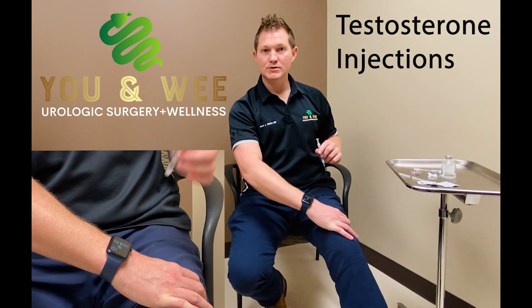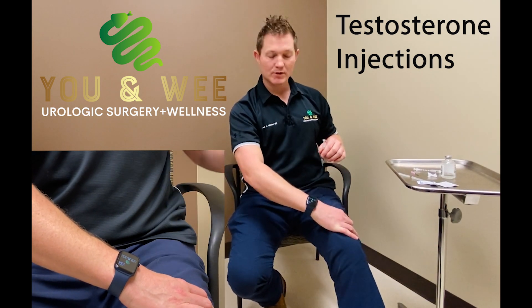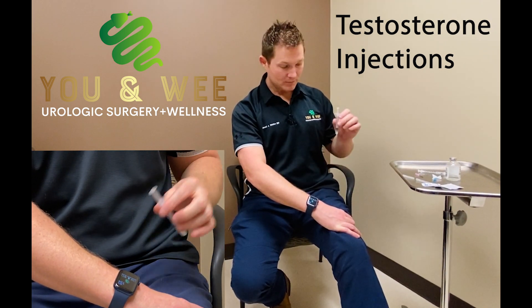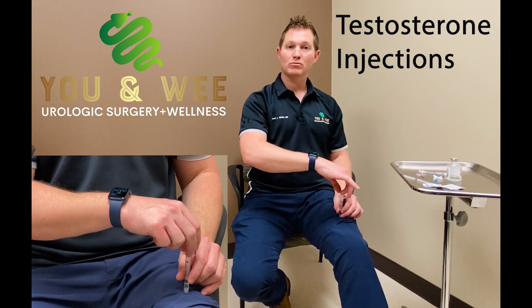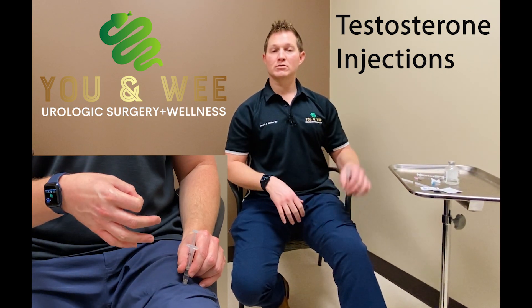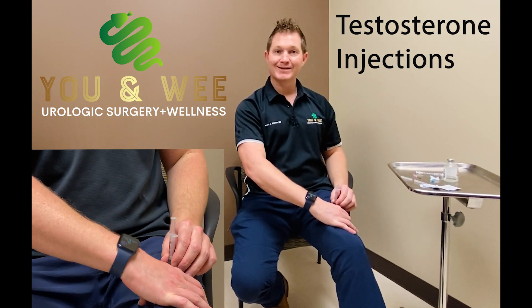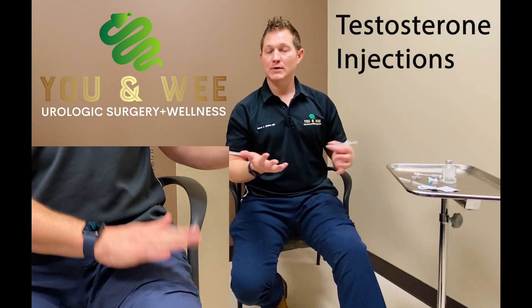Grab the muscle on your thigh and make sure your leg is nice and relaxed — you don't want to tense up. After you've cleaned the site, grab the muscle and squeeze it in your hand. Then poke the needle into the skin. The very first thing you do is pull back on the plunger and make sure no blood comes into the syringe. If you see air bubbles, that's fine — no big deal. But if you see red, pull out and restart. Get all the air bubbles out, grab the thigh again, stick the needle back in, and pull back again. If you don't see any blood, go ahead and push the medication in. That's your injection.